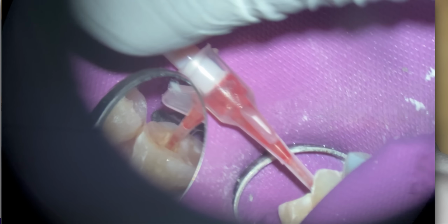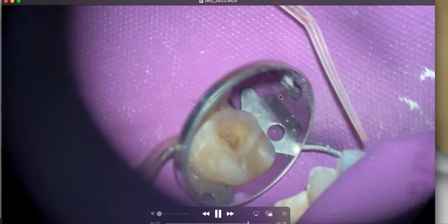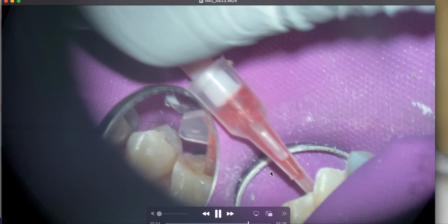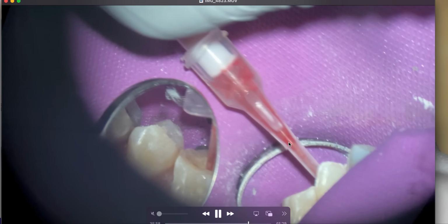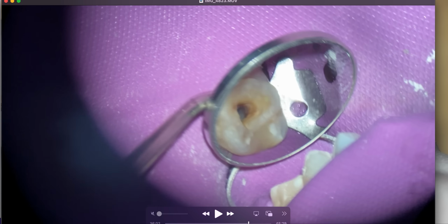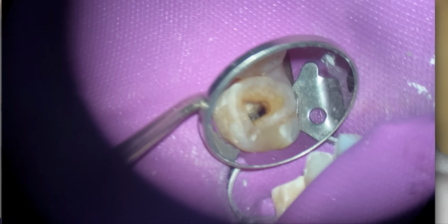And if you're wondering about my rubber dam, I just did a DO restoration before, because he's a high caries risk. See those tears? I just finished this DO restoration before we did that, and that was from my finishing bur getting wound up into the rubber dam. So you can see here now it's pretty darn dry. Nothing is flowing from that lesion.